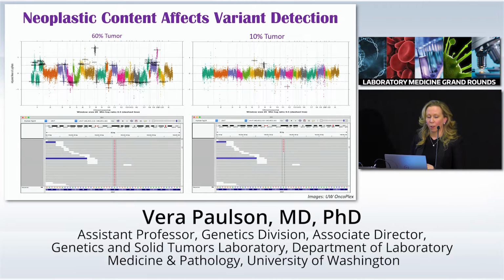So here we have BRAF V600E in a melanoma. I'm able to tell the clinician that their patient is positive. They can get a drug. And here we might miss it because it's only a couple of reads and it's under the limit of detection of our assay.